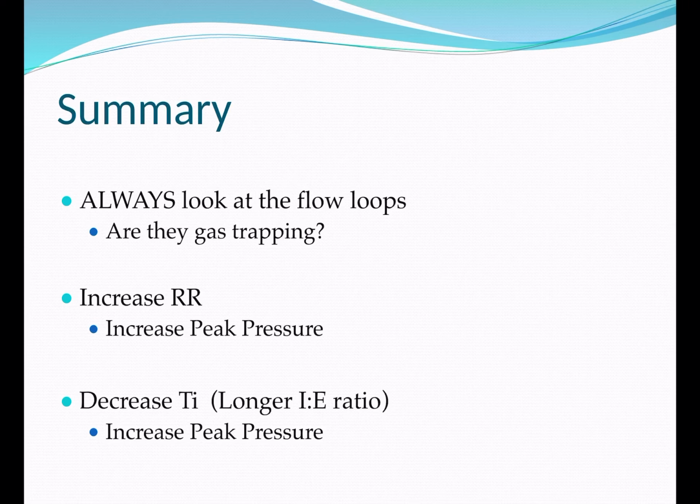You've got to think about your barotrauma, and at the same time, you've got to make sure you've released all of the gas that you've put in with every breath. Otherwise, you get breath stacking, and that can lead to significant problems with hemodynamic instability. It can lead to something similar to a pneumothorax or actually cause a pneumothorax by increasing your intrathoracic pressures so much.